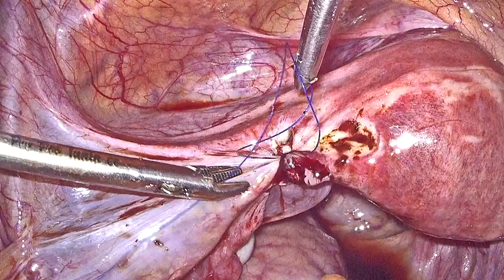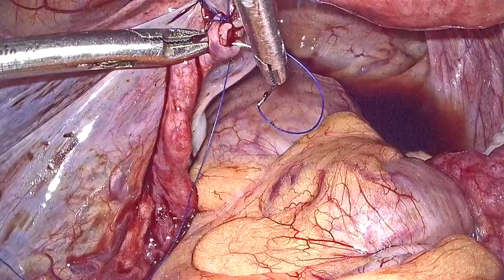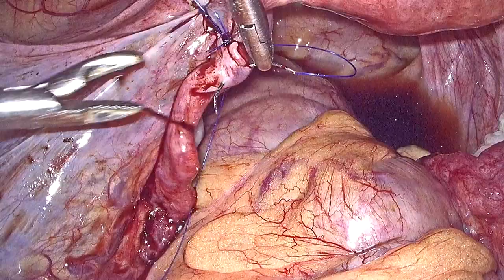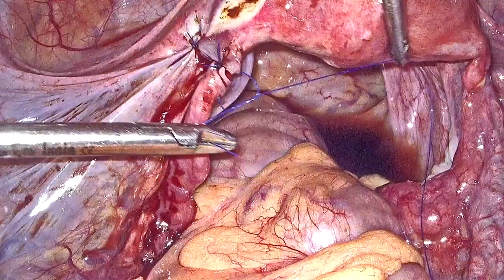Suturing for laparoscopic tubal recanalization requires microsurgical instruments, which are typically 3 mm laparoscopic instruments as you can observe. Two needle holders are used — one to hold the suture material and needle — both being 3 mm laparoscopic needle holders. It takes considerable skill to place prolene sutures at various angles towards the freshened edges of the two stumps, and in the end both stumps are uniformly approximated to each other.